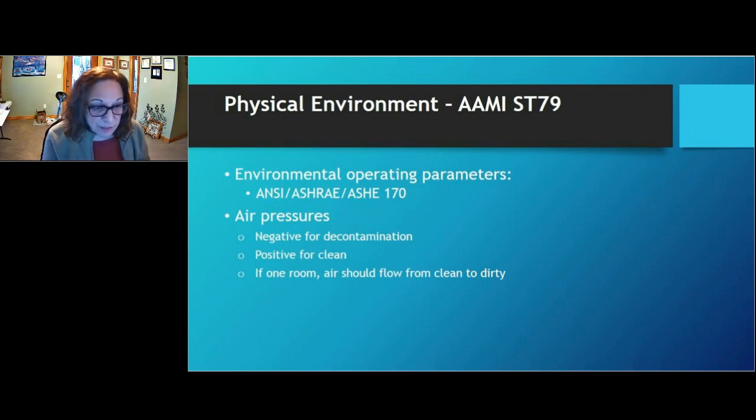Now, with that said, I will remind everybody that the wrappers, the peel pouches, the chemical indicators, the biological indicators, those are the things I can think of offhand. Those kinds of supplies, generally speaking, most of the manufacturers of those products tell you that these items must be stored in a specific humidity and temperature range. So you want to try and meet those to ensure that your sterilization tapes and everything don't just start changing colors because it's too warm where they're being stored.